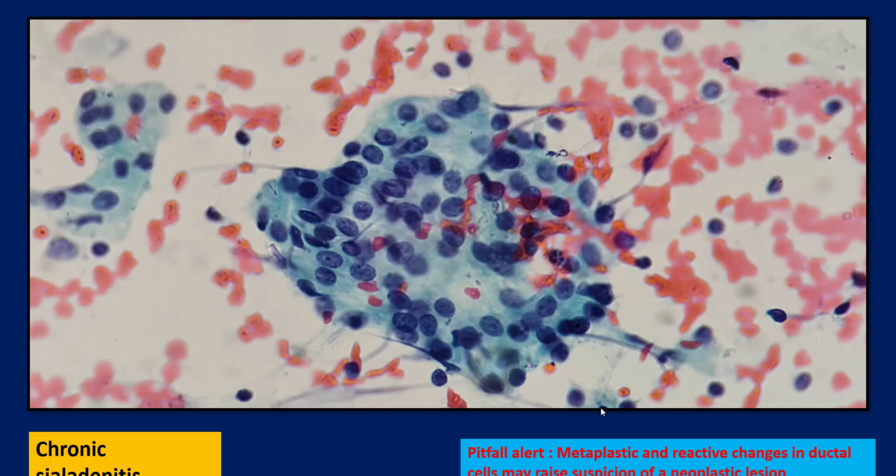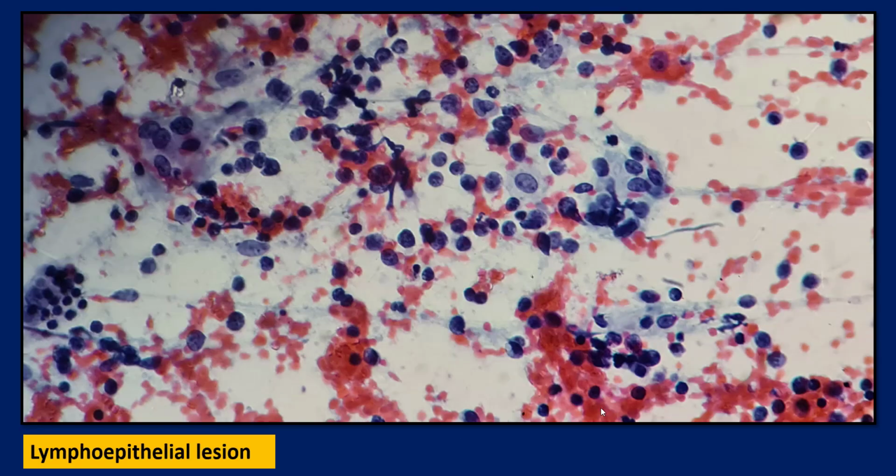The next one is a case of chronic sialadenitis. Now, in a chronic sialadenitis, the number of lymphoid cells is not really that high, but what you see are a lot of salivary duct cells, as a result of which, if you remember the previous lecture, it came under the differential diagnosis of basaloid lesions, although they're very hypocellular. But what creates a problem is that sometimes you can have metaplastic and reactive changes in the ductal cells, which may raise the suspicion of a neoplastic lesion. So one needs to be aware of this particular fact.